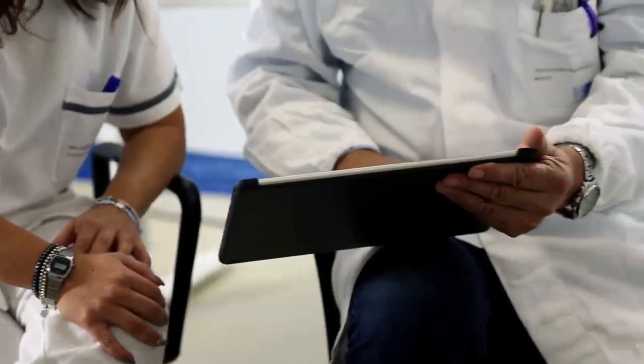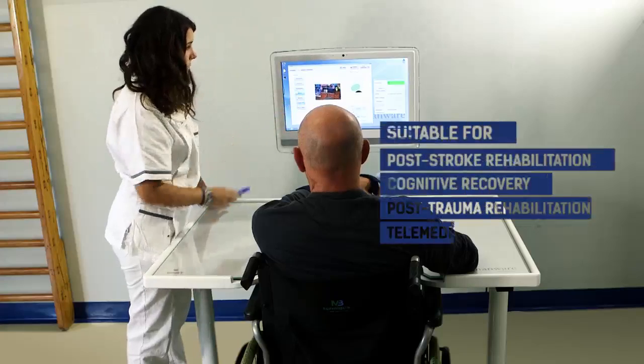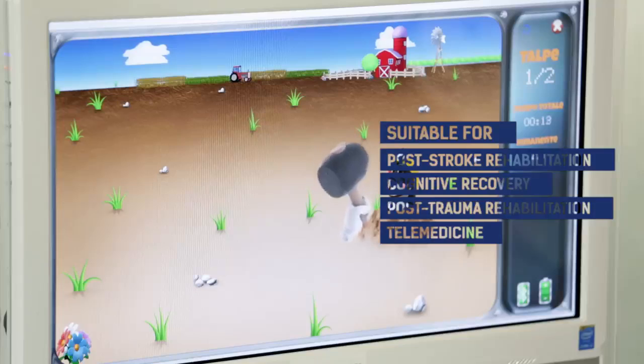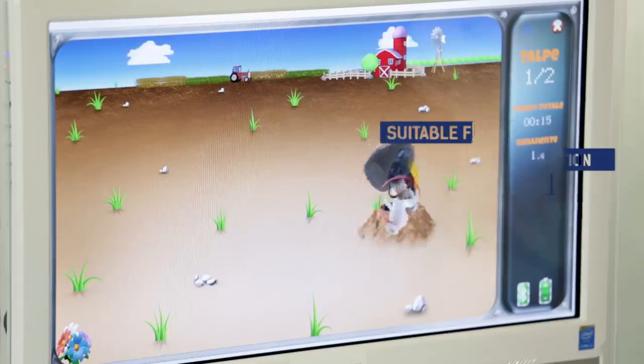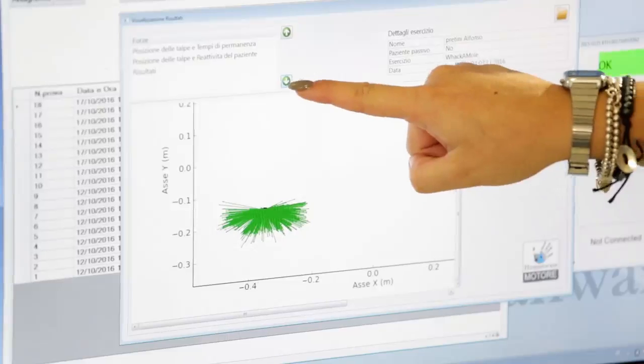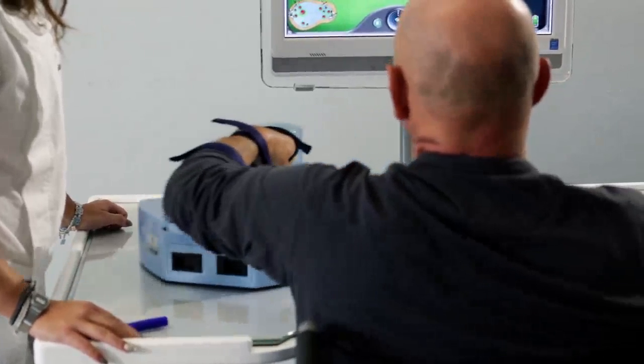Clinical research has shown that robotic devices are an effective tool for neurological rehabilitation. Using a device such as Motore has several advantages: it can make rehabilitation more interesting, lessen the physical burden of the patients and physiotherapists, and helps in the evaluation of patients' progress in order to better calibrate the ongoing rehabilitation.